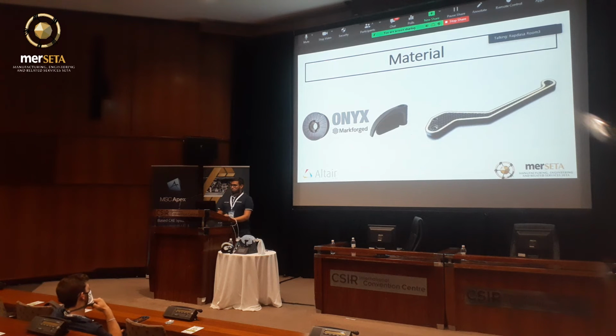So most of the parts on the ventilator system are additively manufactured in Onyx, which is a composite of micro carbon fiber filled nylon. The reason we chose this material is that it offers high strength, toughness, and chemical resistance when printed alone. And furthermore, it can also be printed with reinforced continuous fibers such as fiberglass, carbon fiber, and Kevlar. And when you reinforce the Onyx with these added materials, you can get aluminium strength parts.